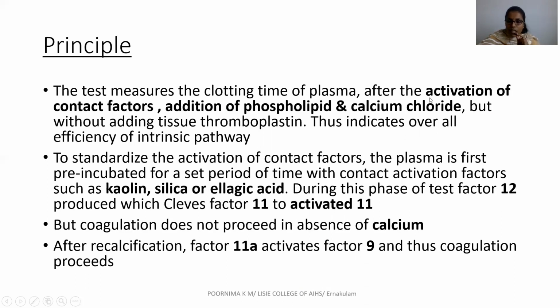Okay. First, we are adding the contact activation factors because the reaction is not carried out within the body. Here we are doing an in vitro test. Okay. So suppose if a cut or wound is happening, contact activation factors, that is platelet, initiate the intrinsic pathway, right? So there is no need of external contact activation factors.